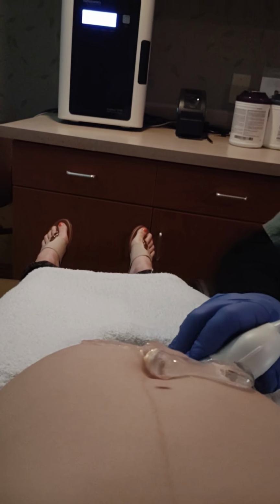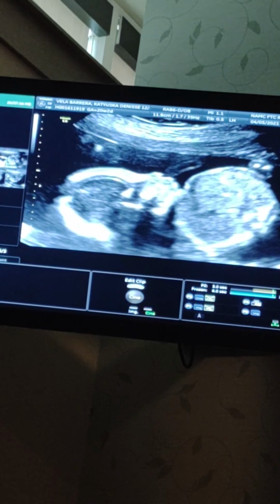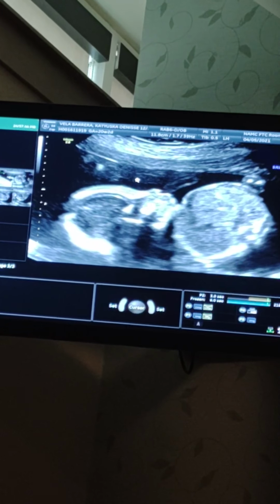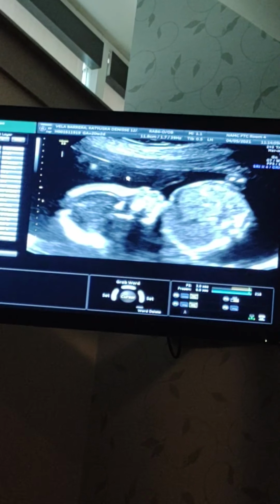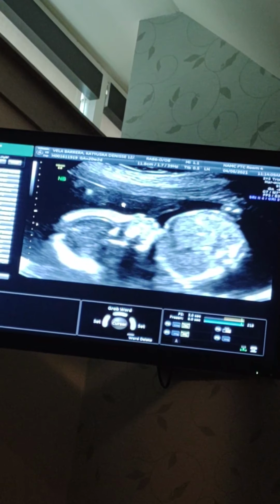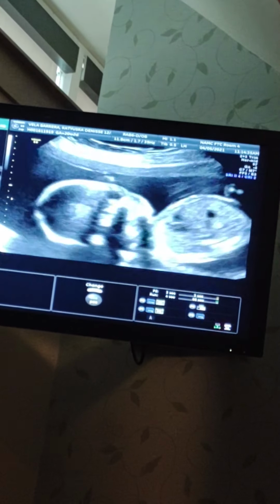Face here a little bit. Got the little hand up by the nose. There's a profile, and I see the bright white here. That's the nasal bone, and that's something we look for the presence of, so we know it's a lower risk for Down syndrome. This is one of our screening things. Nasal bone. Okay. And it's looking good. It's just looking good.